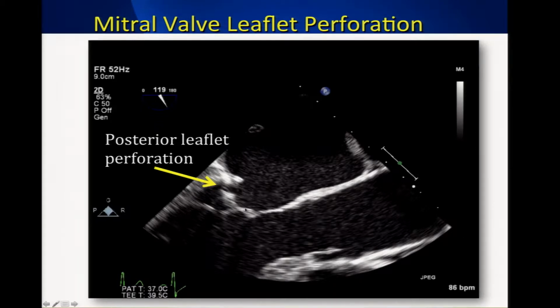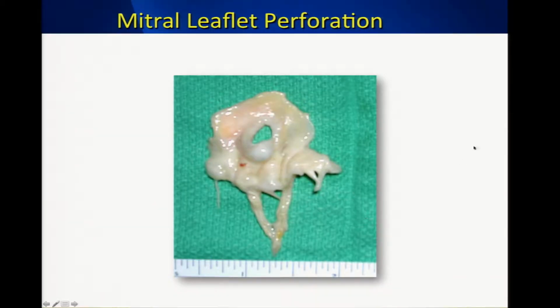Okay. So there's the perforation. And this is very focal, right through the clear zone of the mid portion of the anterior mitral leaflet. That's the sort of destruction it can get. And this one is neat because it has a heaped up function. This is what can happen. You get the windsock deformity. Anybody who doesn't know what a windsock is, you just have to look outside when you're in an airplane and you're on the ground at the airport. Those things basically look like a sock and show which way the wind is blowing. But basically they're contained typically.